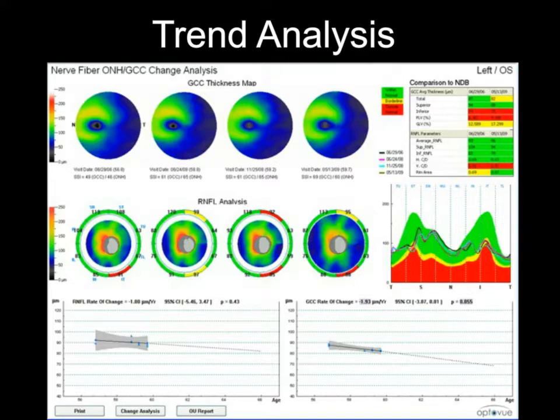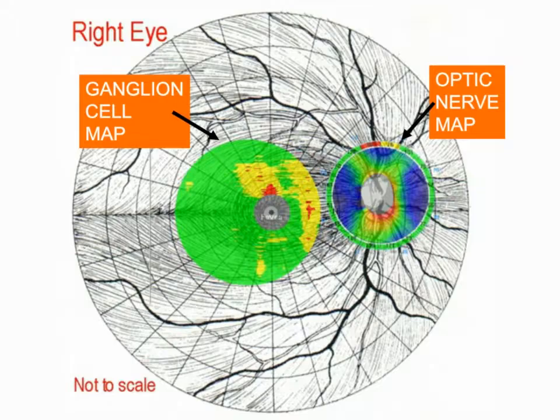So when we look at glaucoma, where we've really evolved and added this new metric, this new thing to consider with our glaucoma management patients, is this metric called GCC, or ganglion cell complex. Here's really what the GCC is. It's a measurement highlighted here by this central circle in this picture representing the nerve fiber layer spreading over the surface of the retina. And what it's doing is measuring the thickness of the nerve fiber layer, the ganglion cell, and the inner plexiform layer, which is essentially where the dendrites of the ganglion cell communicate with the inner nuclear layer. So you're looking at the thickness of that ganglion cell, and determining whether there are changes in thickness to that area over time.